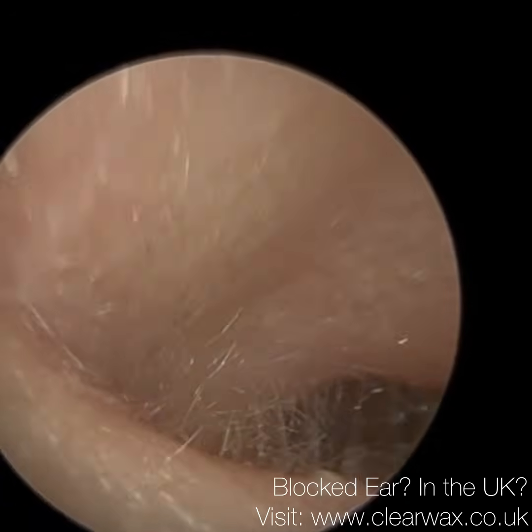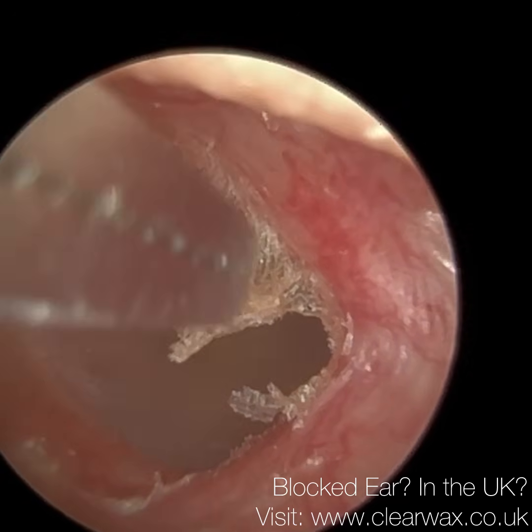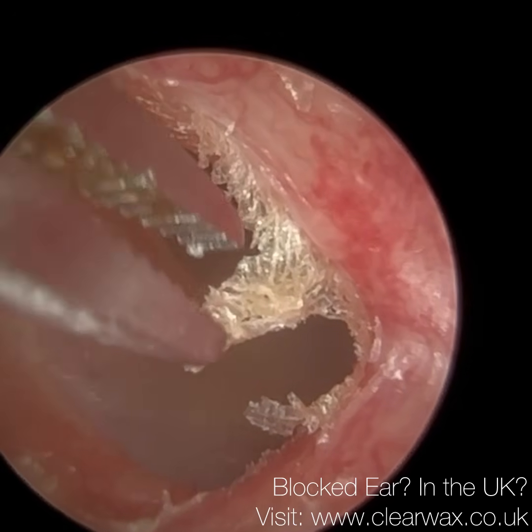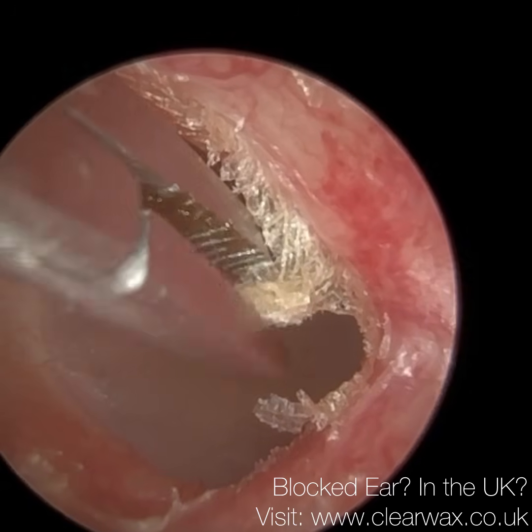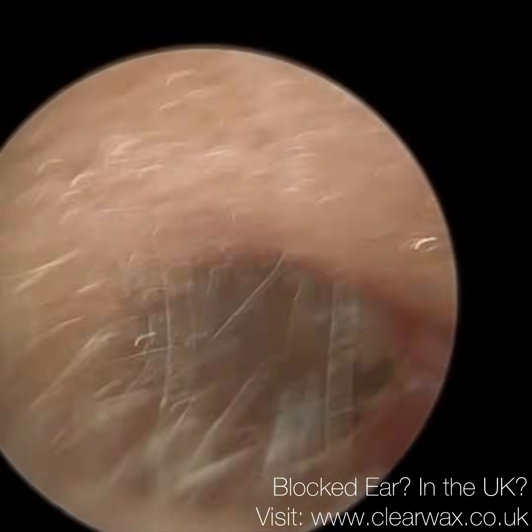I think I have one more go with the forceps. And I managed just to get the jaws either side around it, but I think that's it really.